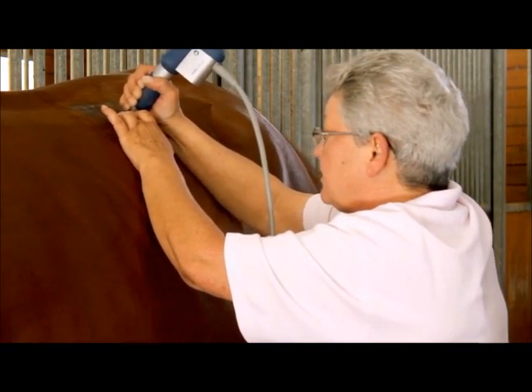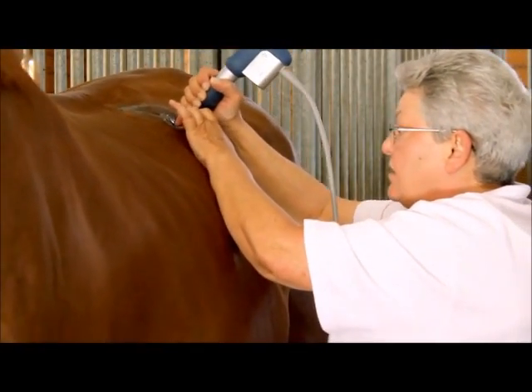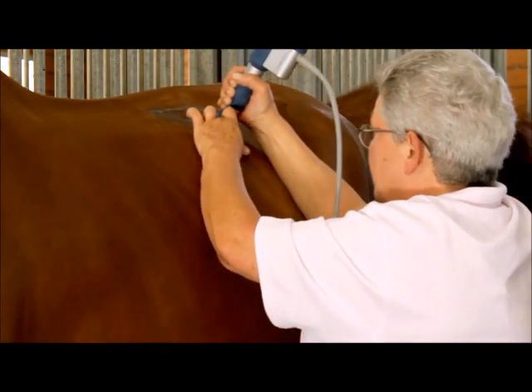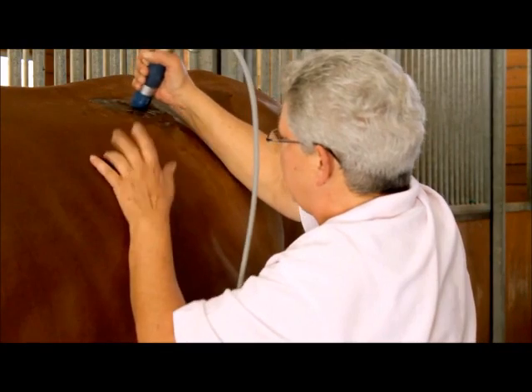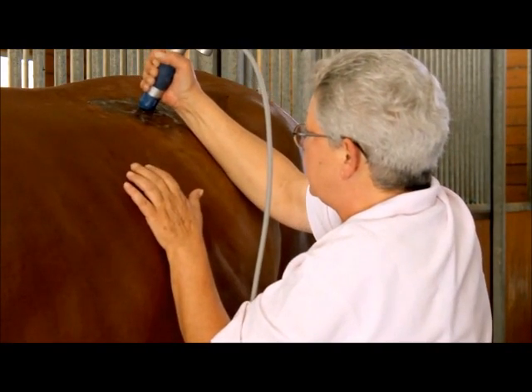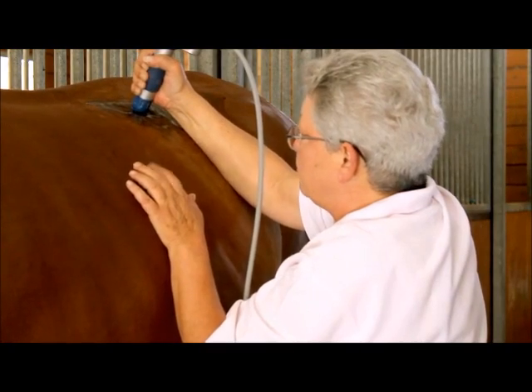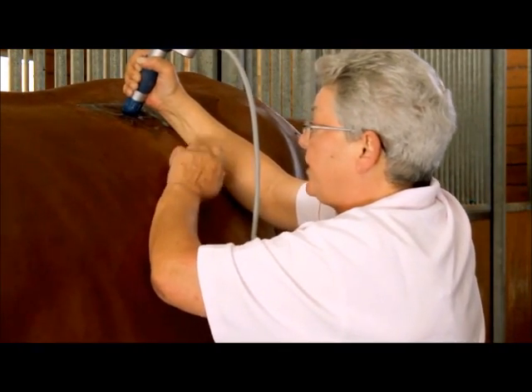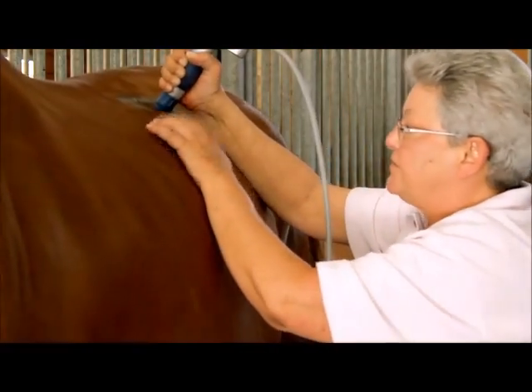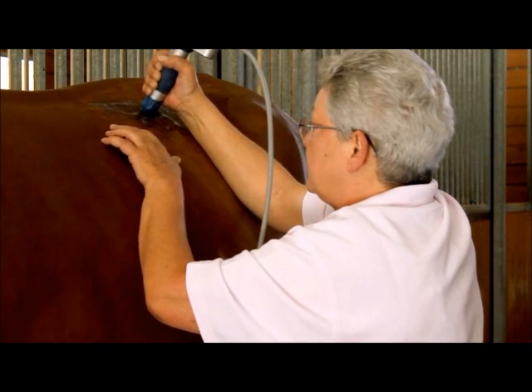And normally, how long is the treatment? Because first you have to go and find with your fingers where the tight spots are. And then you have to go with the shockwave onto that point. And you have to do as many shocks as you can see the release of the muscles.